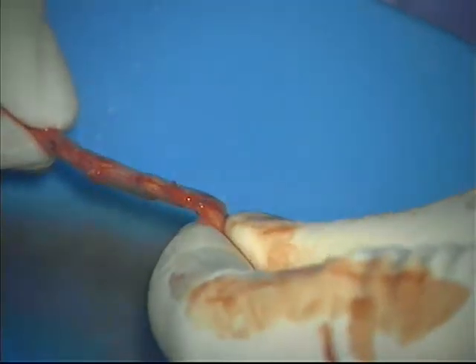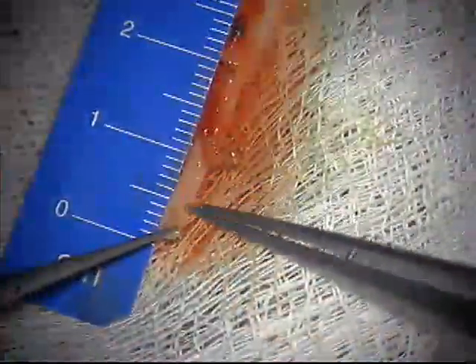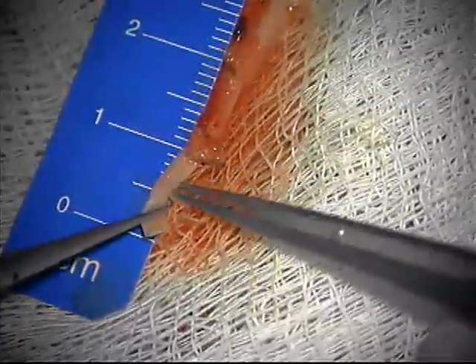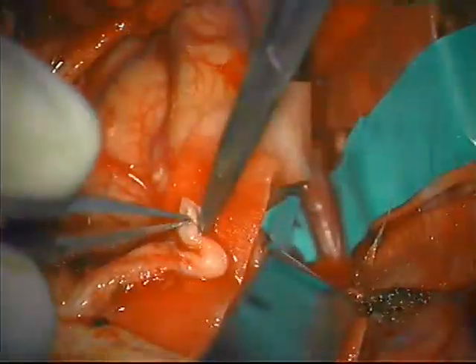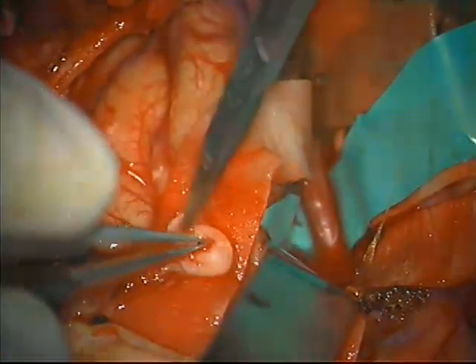We prepare the radial artery with a solution of nimodipine and high pressure to avoid spasm. The last centimeter of the artery is cleaned of adventitial tissue, and the distal end is opened in a fishmouth fashion.